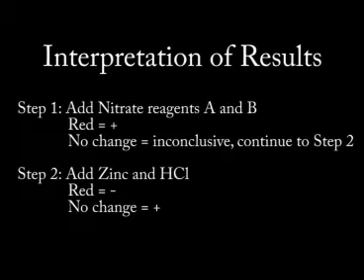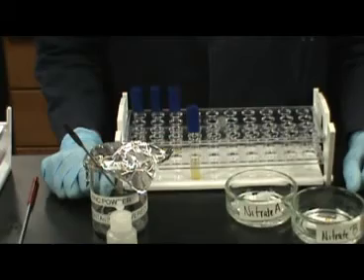In step 2, you will add zinc powder and hydrochloric acid. At this point, if the tube turns red, the test is considered negative. If there is no color change, the test is considered positive.